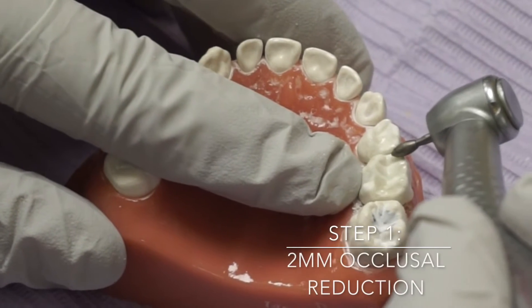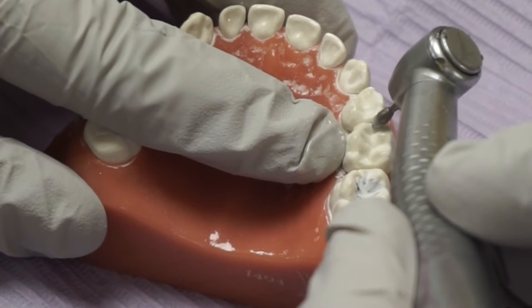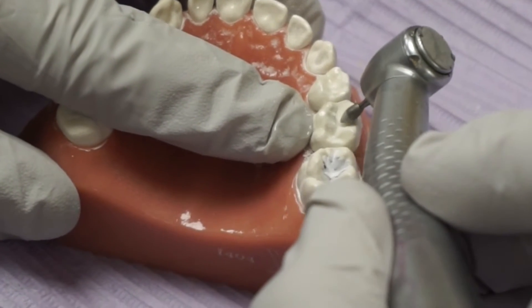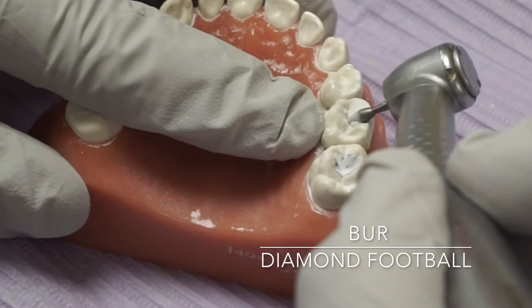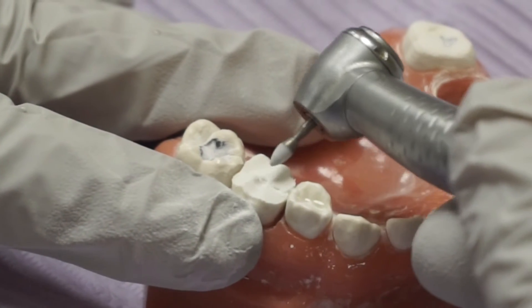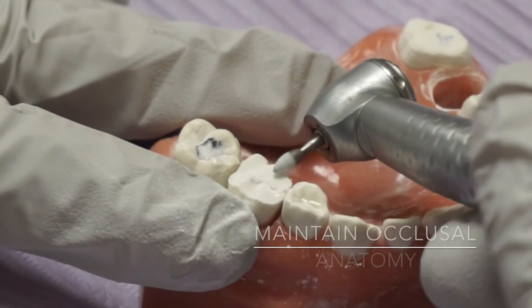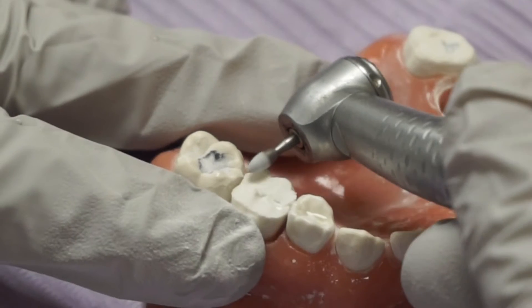So the reduction — I can angle my burr also. It's almost like I'm prepping it flat, but notice I'm still giving it some anatomy. The more surface area you have, the more retention.